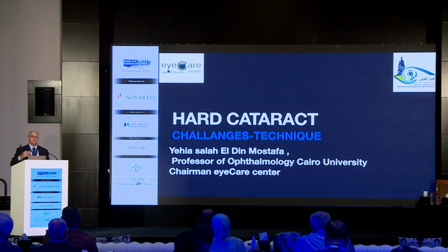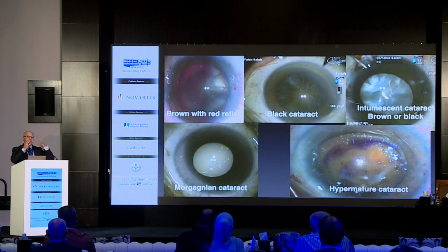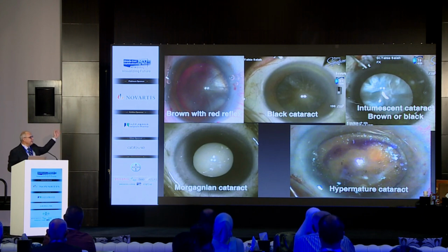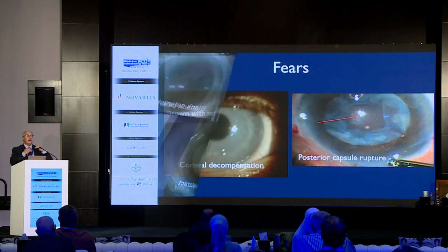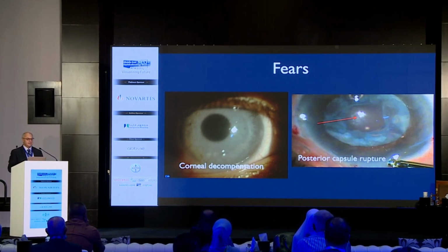One of the important things in our area, we see hard cataracts, as Dr. Safwan has shown, and in my opinion, we should really have a system, an understanding of how to deal with these cases reproducibly with good results without fearing these cases. So the hard cataract can be any one of these types. So you have to deal with each one with its specific challenges. But always you have to analyze what you are worried about in such cases.